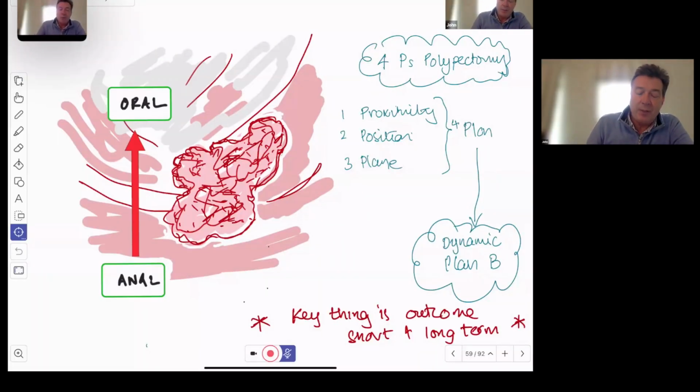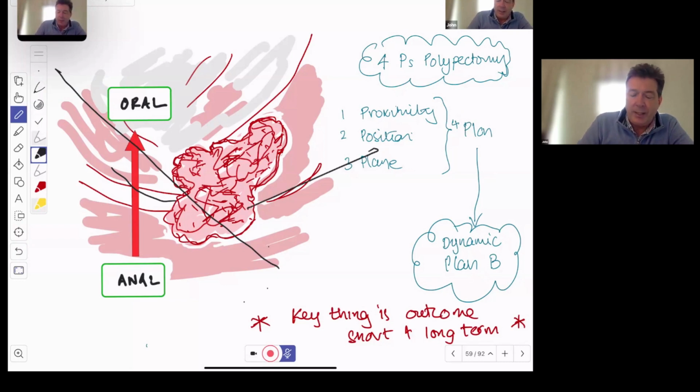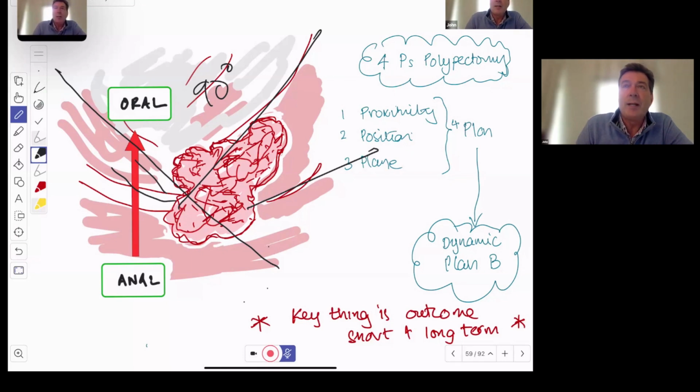And when you review the video, you'll see the first image of the polyp looks a bit like this, right? We've got a really good view. It's at 6 o'clock. Everything looks perfect. But, and it is a big but, you've got a fold here and you've got a plane in this direction. You've got a fold here and another fold here in this direction. And they're at 90 degrees to each other. And you've almost certainly got, because of the size of the polyp and the location, some submucosal changes. And they consisted of both fat and possibly a little bit of fibrosis.